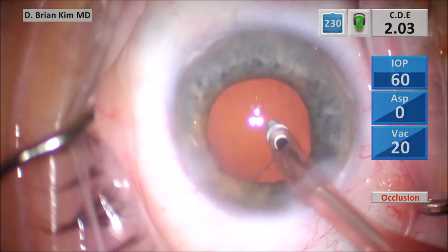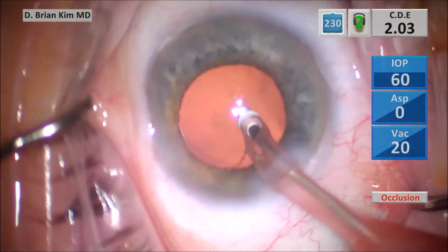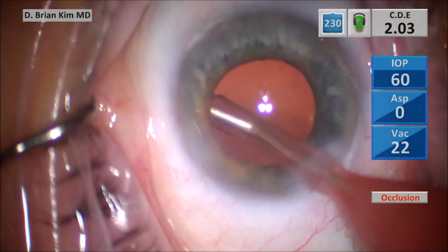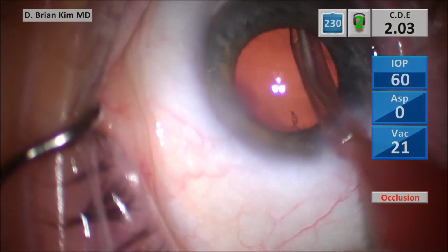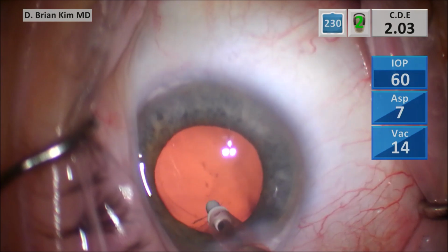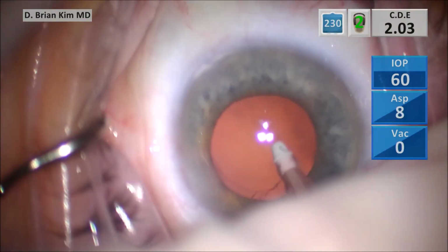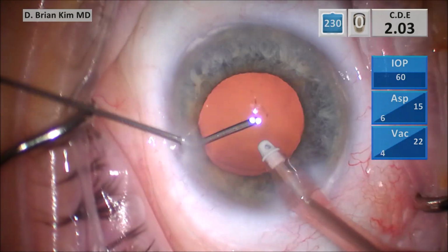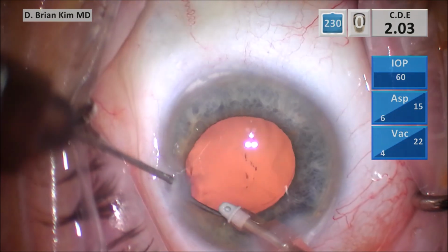Number 2, do not use vacuum to grab the lens pieces. If you use high vacuum near the pupillary edge, you're going to grab the iris. And so this is very dangerous. So a better way is to use mechanical fracturing forces, which does not rely on high vacuum, to grab lens pieces, to impale the lens for chopping maneuvers.